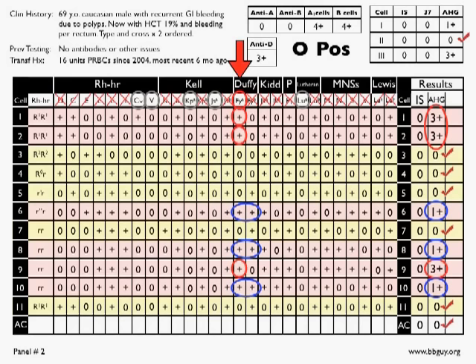Now, do you have more work to do? Yeah, you're going to want to phenotype. You're going to want to make sure that this individual is Duffy A negative, and that's the way this would look at the bottom of the panel. You may have some additional work to do.